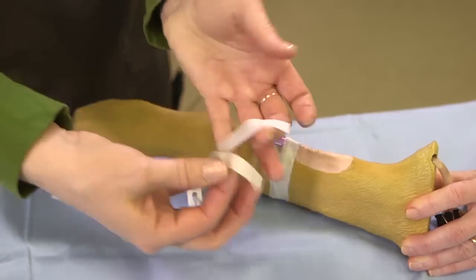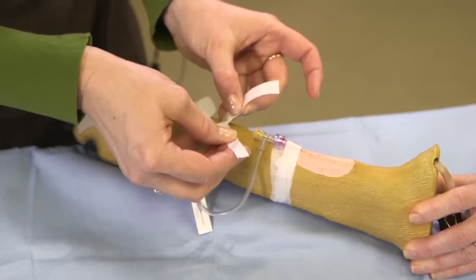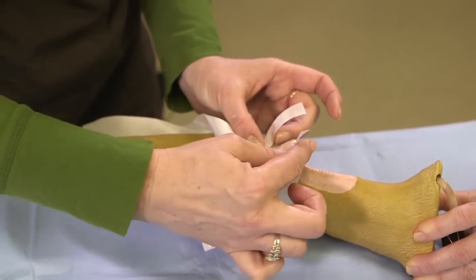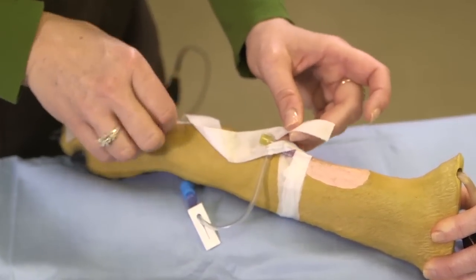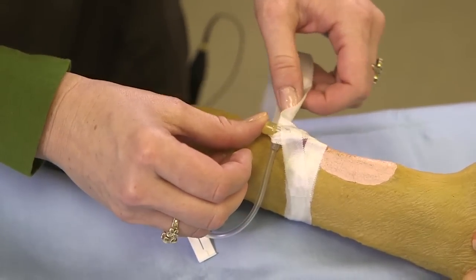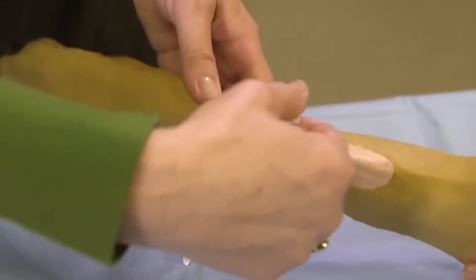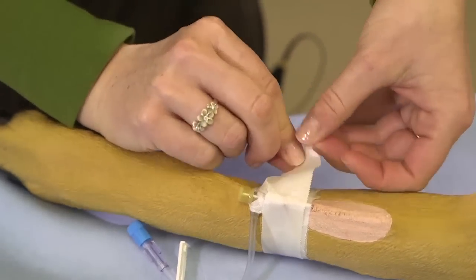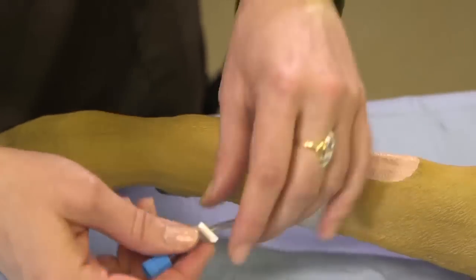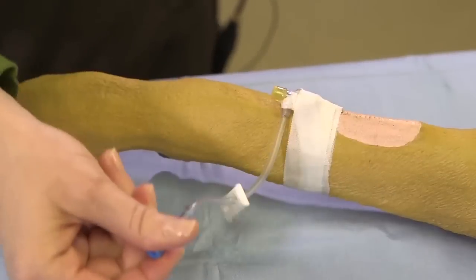Lastly we have what some of us call the Y piece of tape. It's a regular unripped portion except for the very top. Go under the port here — you have this extension of the T-port. Take one piece, go over that, and crisscross on top of the catheter. This side comes over this portion of the catheter. Secure down and pull this tape in the direction away from this port so it's nice and snug. Go around your catheter and leave a little tab on this side. That is your IV catheter with T-port, and you can use it in order to inject any drugs or fluids.